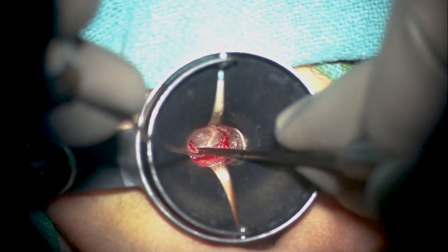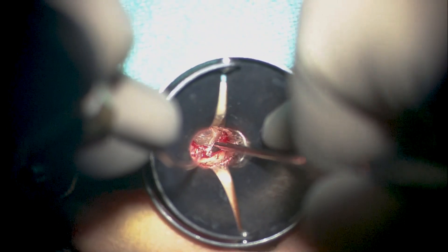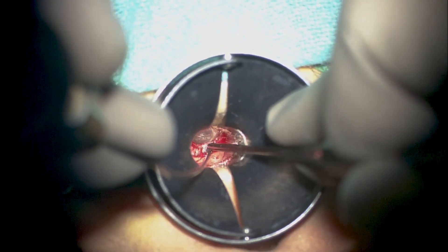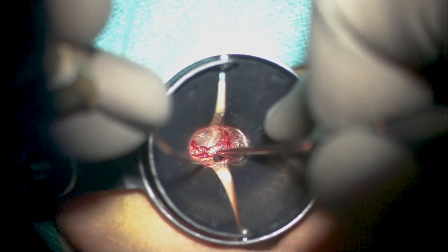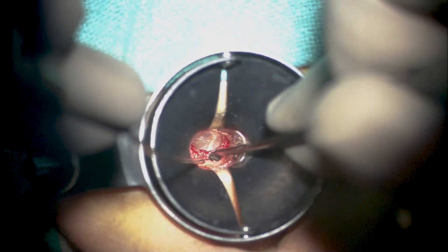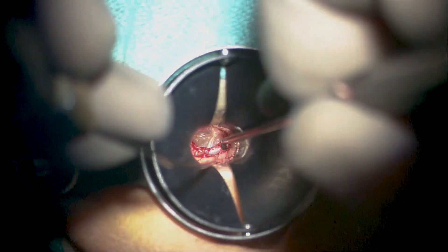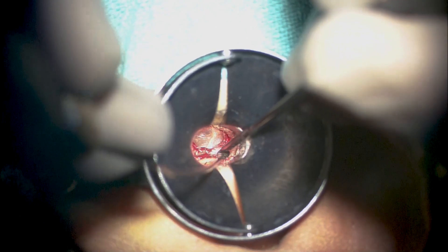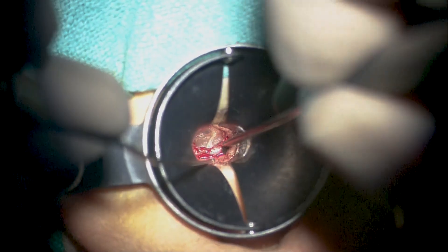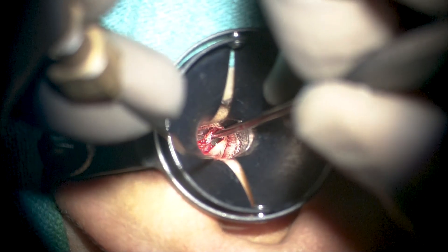We are using here a self-retaining speculum in the ear to get a comfortable, secure grip in the external canal, and standard elevators to elevate the canal skin. It is preferable to elevate the entire canal skin with the pocket wherever possible, so that one is very sure of not leaving behind any epithelium on the canal wall or in the middle ear. However, if one does indeed create a small hole, one can again meticulously clear the disease from the ossicles to be sure.